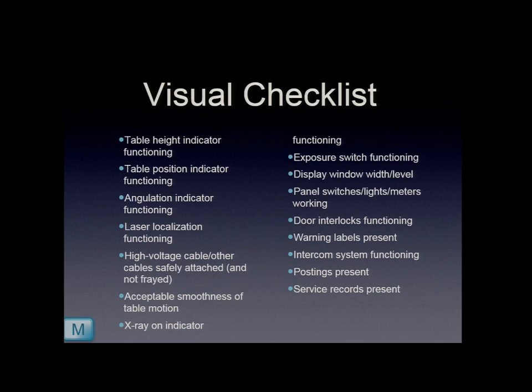When the x-ray is on, does it indicate the x-ray is on? Does that light come on? Or is there a message that comes on that says that the x-ray is on? So that's something at least once a month they should document. Yeah, it does. Okay. So they can do that. The exposure switch, if you hit the switch, does it energize the tube and you get an exposure out of that, or is there some kind of a problem with it? Is there a problem if I try to abort? Does it not abort? That kind of thing. So document those type of things.